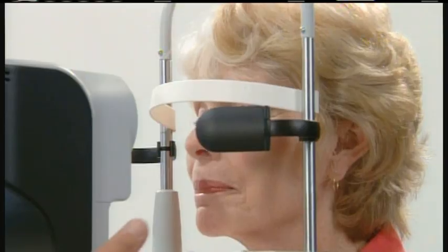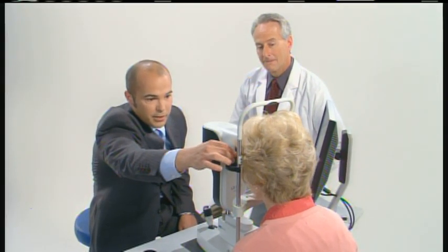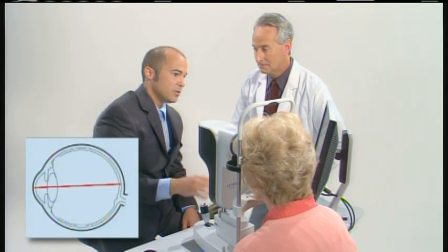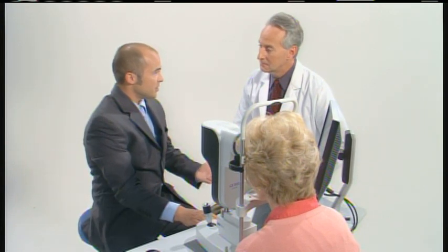We'll have the patient place her head in. Is that comfortable for you? We can use this occluder here to exclude one eye so she fixates a little bit better centrally. Our device captures along the central visual axis, so if she moves off-center, it'll pause the scan.